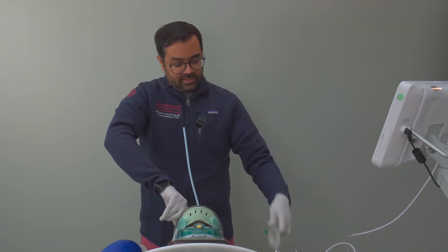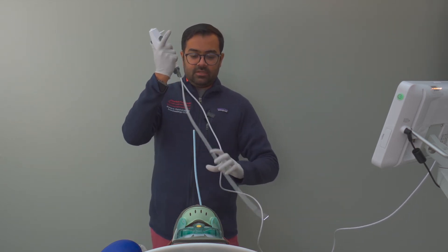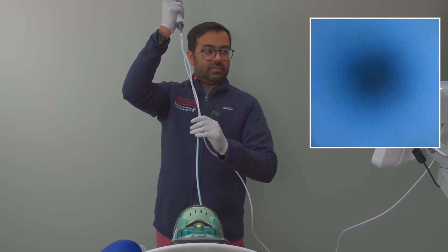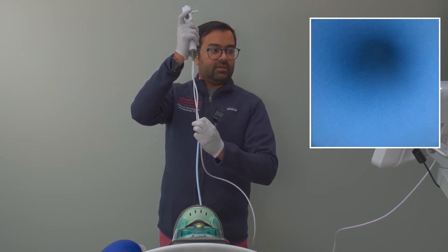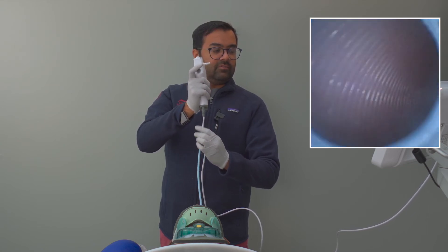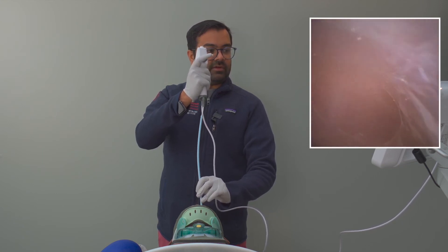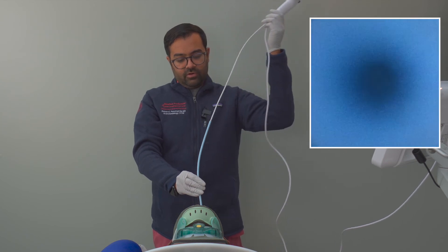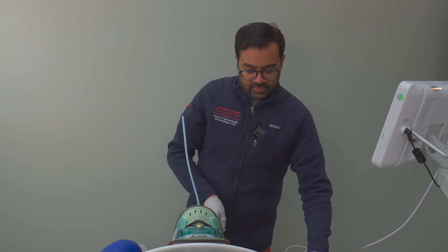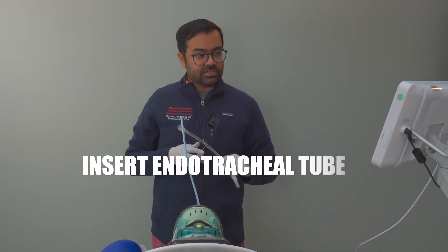The supraglottic airway is out. We can confirm we're still in the airway with the Aintree catheter by inserting our fiberoptic bronchoscope within the lumen of the Aintree. As you can see, we're probably a little deep — there's the carina right there. We're in a great location for the next step, which is inserting the endotracheal tube over the Aintree catheter using Seldinger technique.